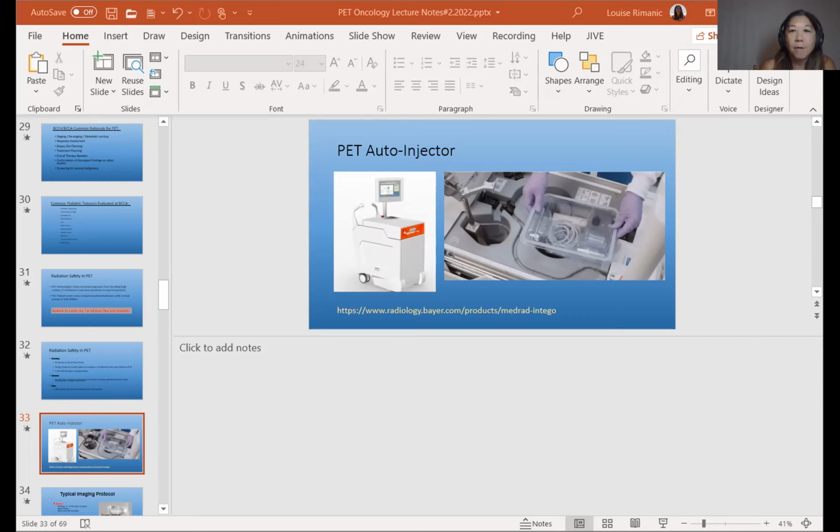After his chemo, though, you can see that the lesion has shrunken significantly. So certainly size-wise, the lesion has decreased in size, but just as important is that the SUV value has decreased significantly. And this is compatible with a favorable response to treatment.